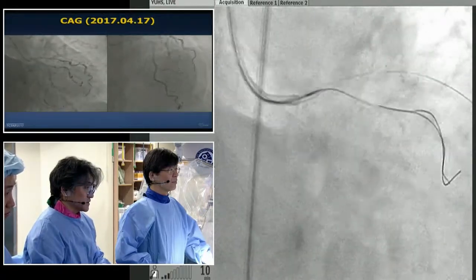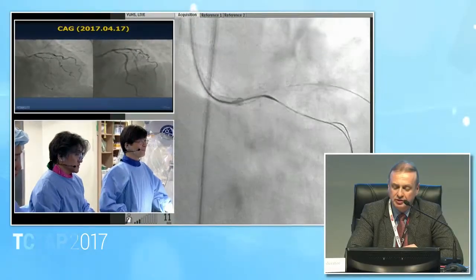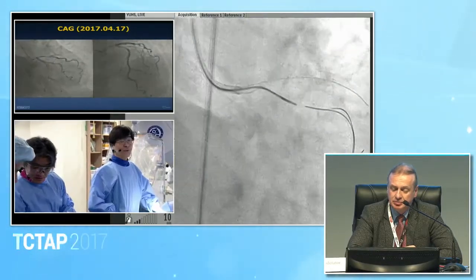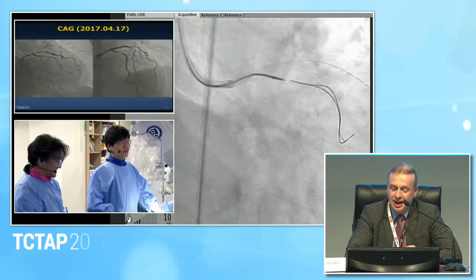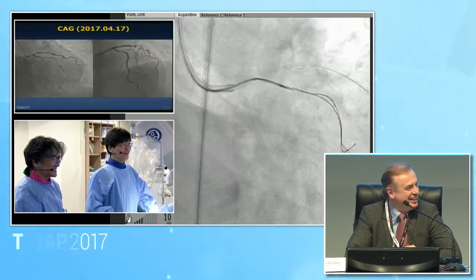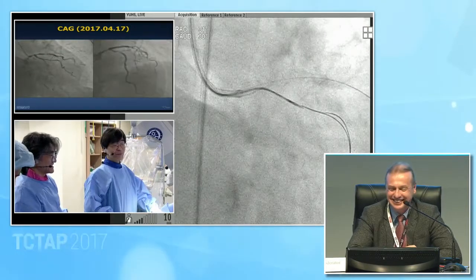Maybe you will explain now what you are doing. You will go to measure FFR. Yes. Excellent. There is some time remaining. We will measure with the pressure wire for the surgery. You have a lot of time. Without the contrast, it's not at least my recommendation. I only ask why you would want to do that. You don't need it. I will finish that.